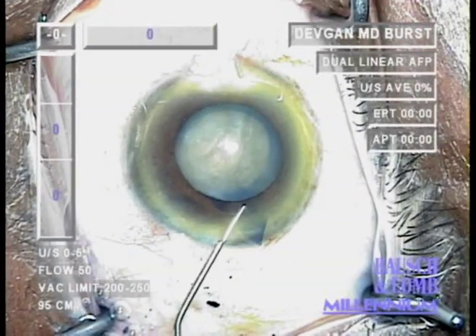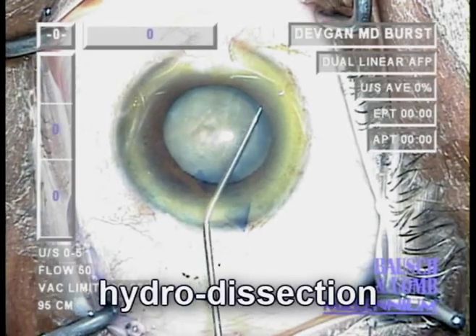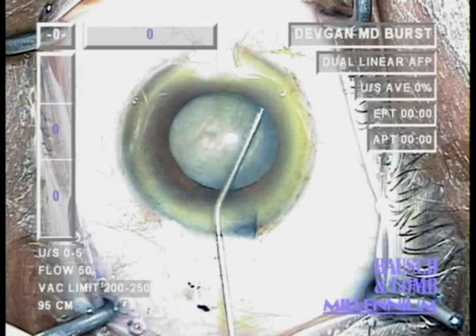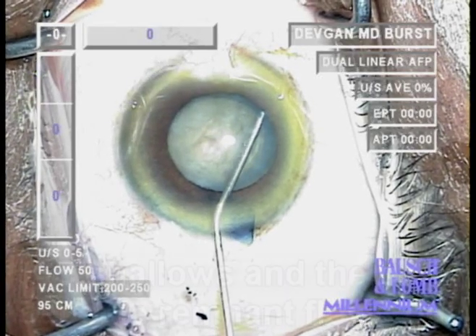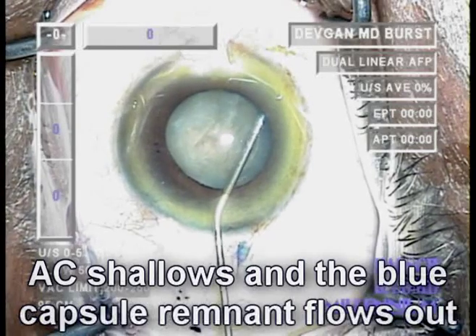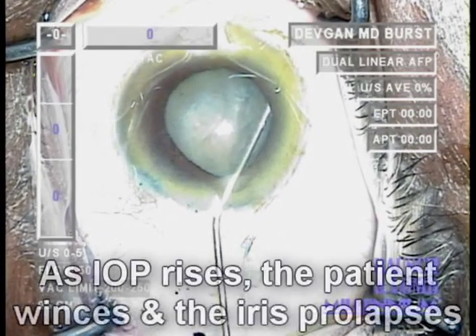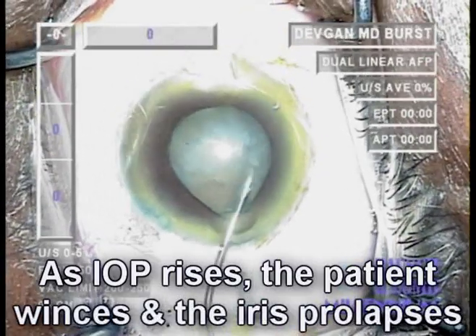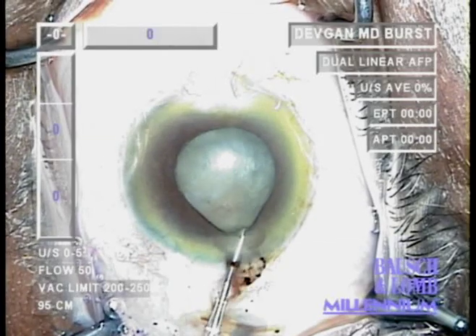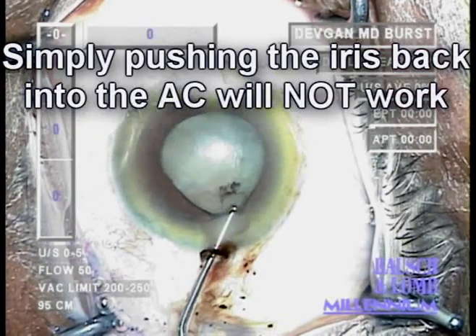We perform some gentle hydrodissection using balanced salt solution and a blunt 27-gauge cannula. During the hydrodissection, the anterior chamber shallows and you see the blue capsule remnant flows out of the anterior chamber through the incision. At this point, the intraocular pressure rises and the patient winces in discomfort as the iris prolapses. Simply pushing the iris back into the eye will not work.